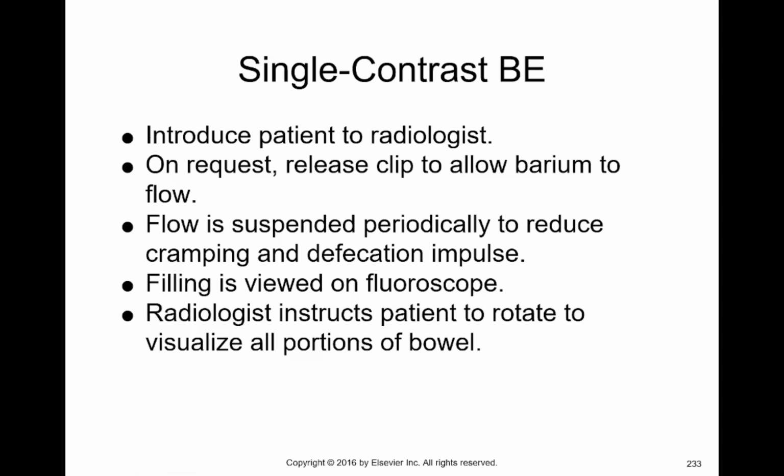So for single contrast BE, we've already been through all the setup, so I'm going to recycle some of the slides from the setup just to review some of that, but I'm not going to go all the way back through all that. This is assuming that you've already completed the setup and you're ready to go.